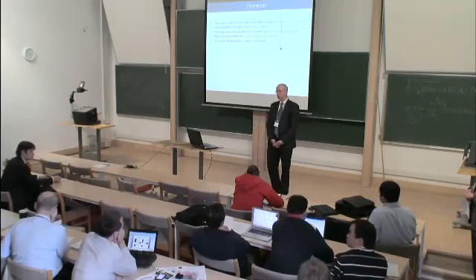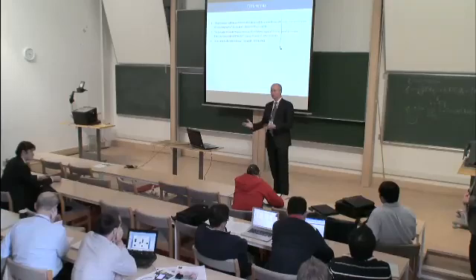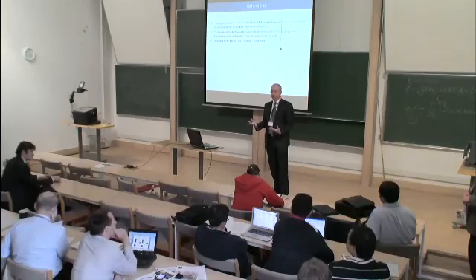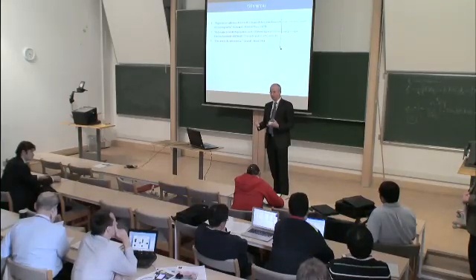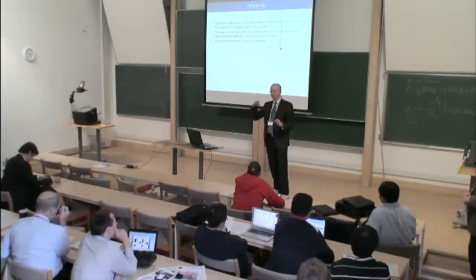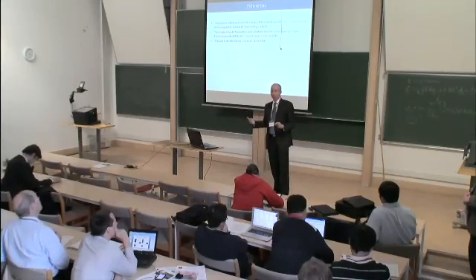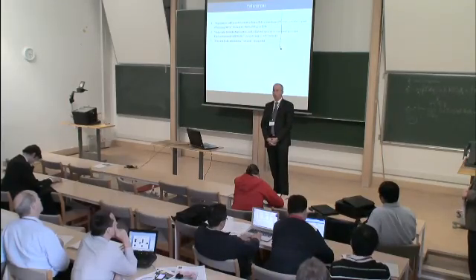It's a good question. It depends on the use of the device. If we're using it for visualization, then our clinical partners have told us that we want to be in the same haustra, so roughly 30 millimeters. Because if you find a polyp in, say, the prone image and click on it, you want to be close to it in the supine image so that the search time is greatly reduced for the radiologist. And if you can be right on it, that's even better. But our clinical partners tell us within the same haustra.